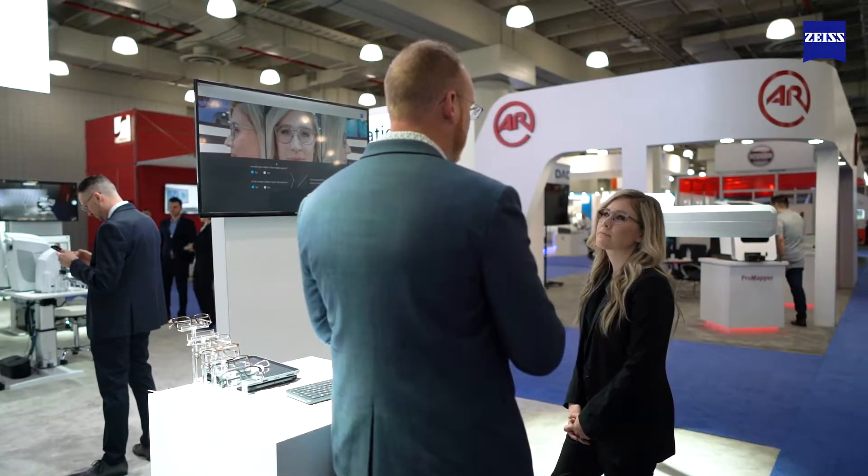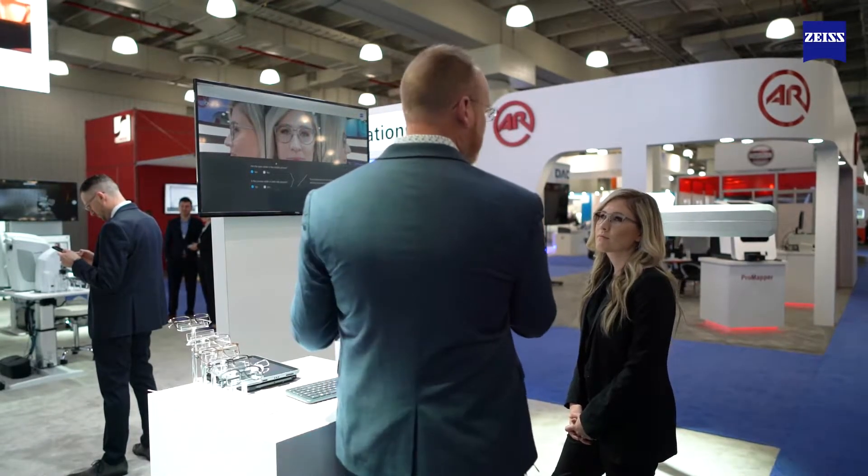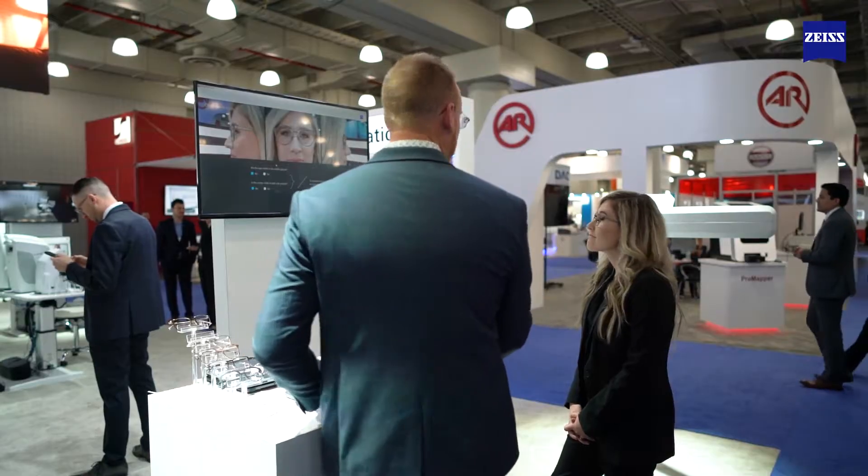So now I can streamline this across the entire staff and make sure that everybody does the measurements the same way. We get the same measurements and everybody's within a range where it wouldn't matter who did the measurements in the office — we can submit that to the lab and get a fully customized pair of lenses for you.